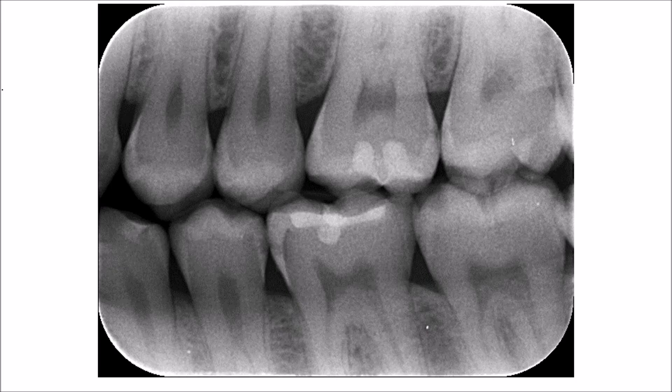This bitwing radiograph shows us the premolar and part of the molar region. Bitwing radiographs are the best radiographs to show incipient caries, interproximal caries, and incipient periodontal disease — that is, the level of the alveolar bone crest plus the calculus which is present interproximal.